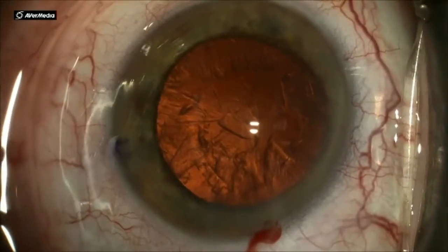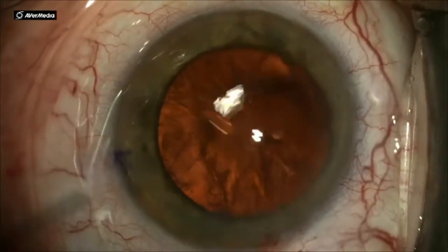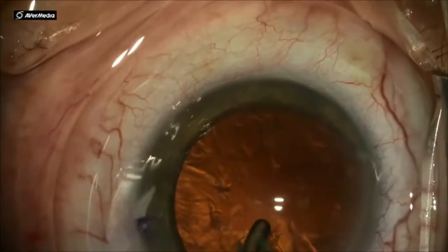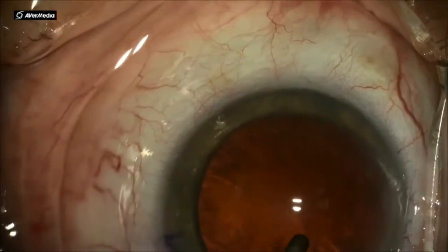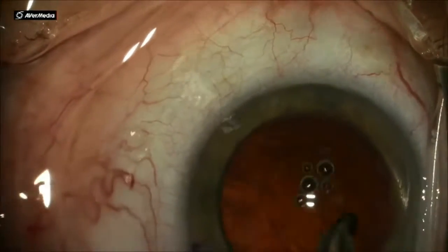Once the nucleus is out, the next step is irrigation aspiration. You just saw me using a 30-gauge cannula through the side port to irrigate any of the trapped material in that incision. Then I start the actual removal of the cortex with a curved or an angled IA tip.